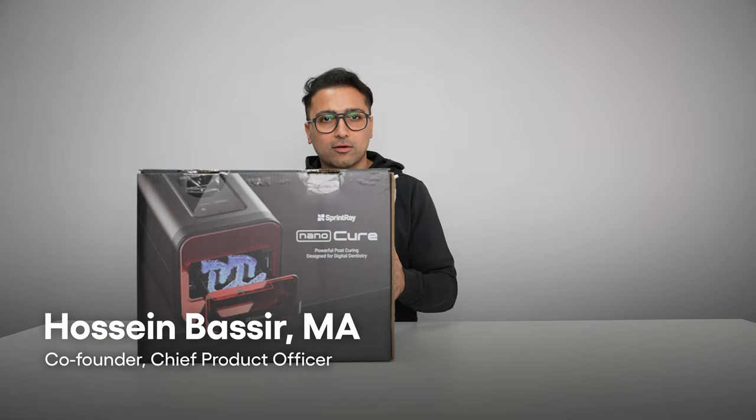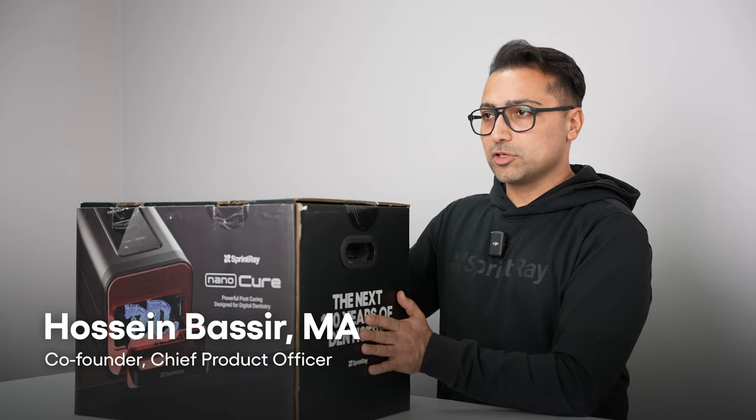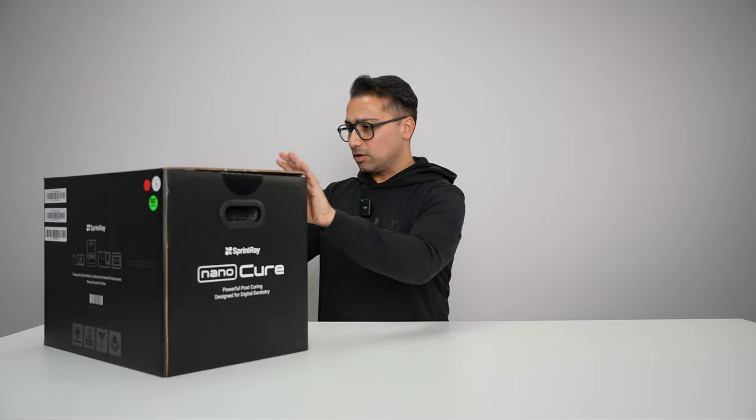What do we have here today? The NanoCure! It's the new product from Sprint Tray. We're gonna unbox it and also go through the features and talk about it. Let's start.